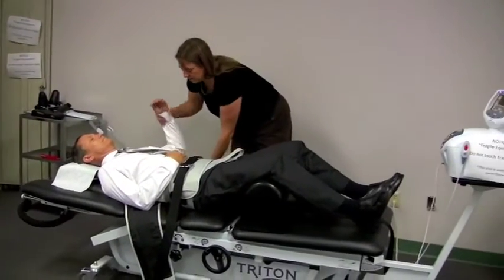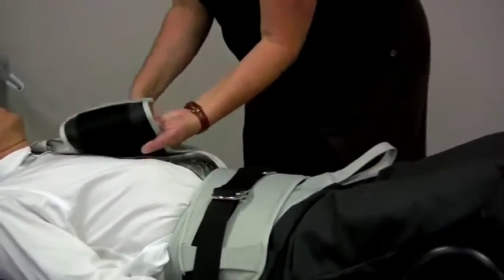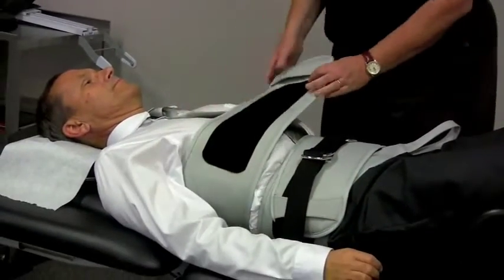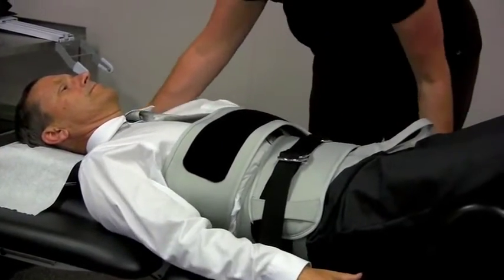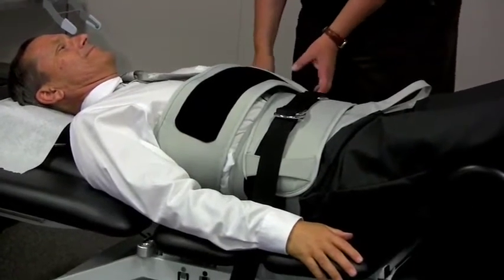The next part is to do the thoracic aspect. This part has to come underneath the armpit, so every patient will be a different length, but this one has to be high enough up. I could actually have him move a smidge down the table. Let's go ahead and have you just, I know you're well, so I can get you to do this, but there you go. See, you went right into the armpit. It stopped you right there.